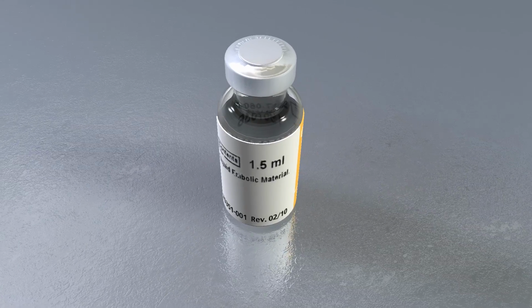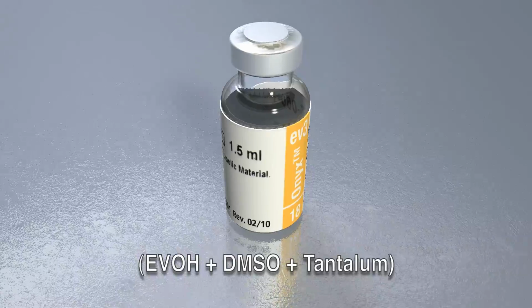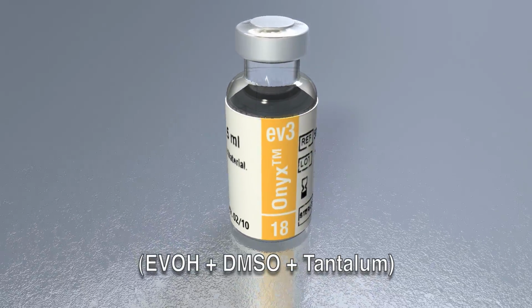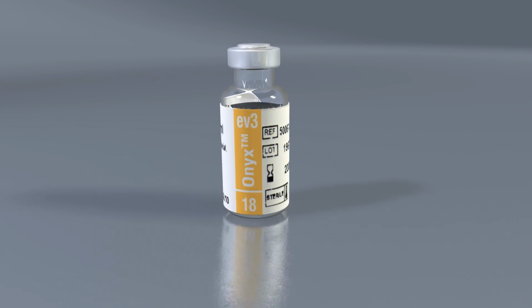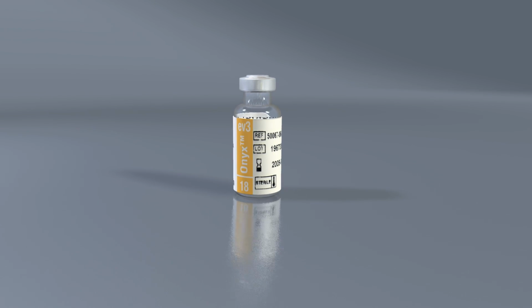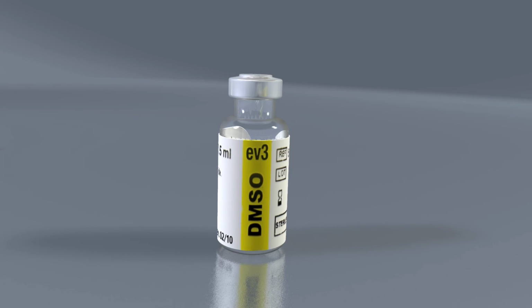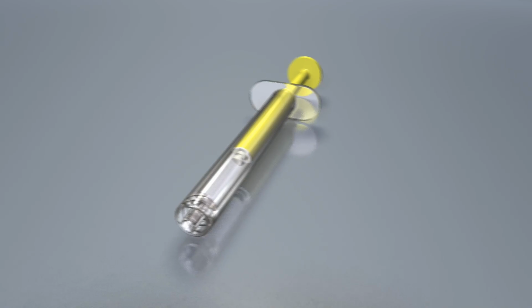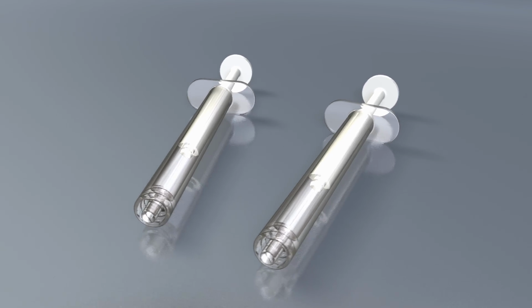ONYX is a non-adhesive liquid embolic agent comprised of ethylene vinyl alcohol copolymer, EVOH, dissolved in dimethyl sulfoxide, DMSO, and suspended micronized tantalum powder to provide contrast for visualization under fluoroscopy. The ONYX liquid embolic system consists of a 1.5 milliliter vial of ONYX, a 1.5 milliliter vial of DMSO, one yellow 1 milliliter DMSO syringe, and two white 1 milliliter ONYX delivery syringes.